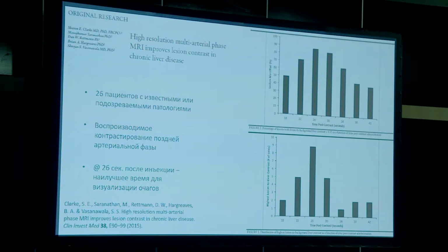I'd like to show you this publication. It was done on 26 patients with known or suspected HCC, and they also used the DISCO sequence with a very high temporal resolution of 8 contrast phases within a single breath hold.